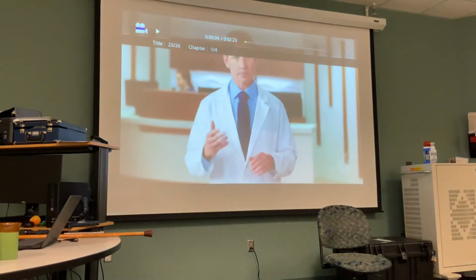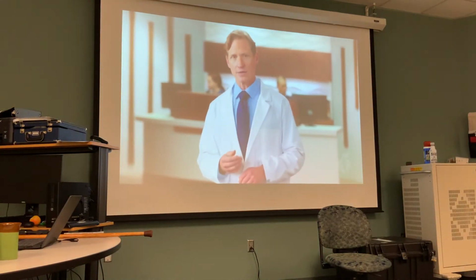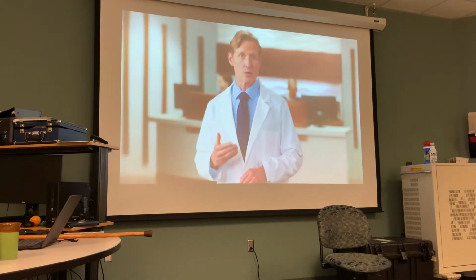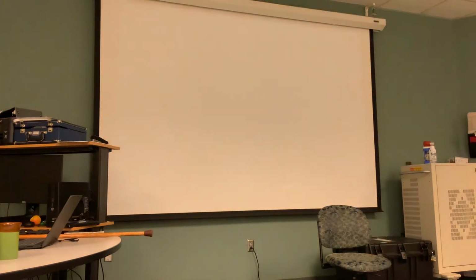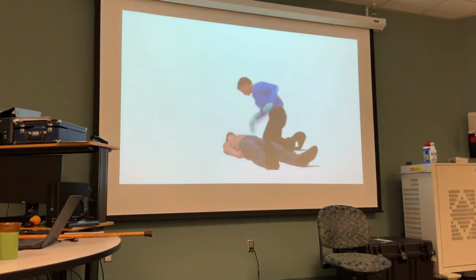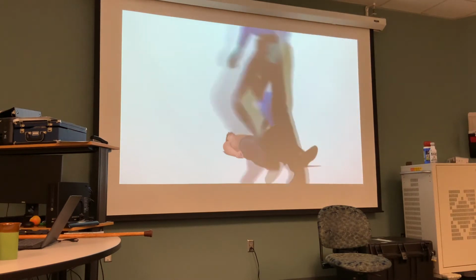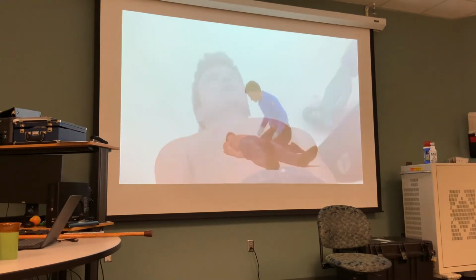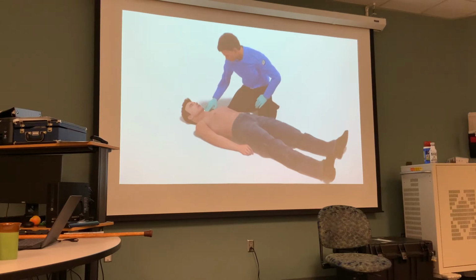So, let's build on these skills. We'll now illustrate 2 healthcare providers assessing and performing high-quality BLS, including the use of an AED. Is the scene safe? Are you okay? Are you okay? We need more help. Call for backup and bring the AED. No pulse. He's not breathing.